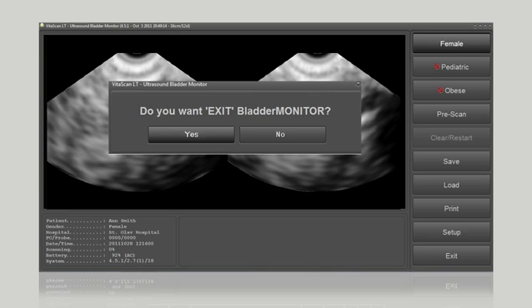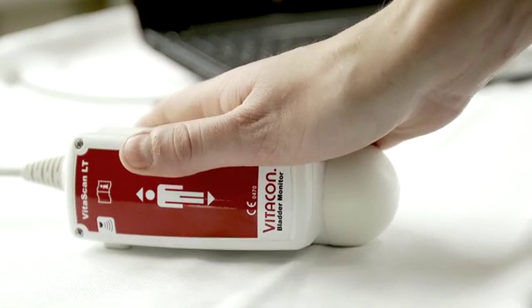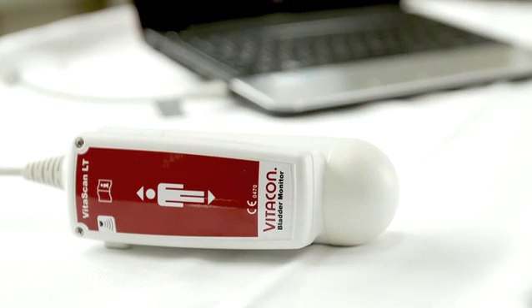Clean and disinfect the probe according to the hospital's guidelines before using it on another patient.